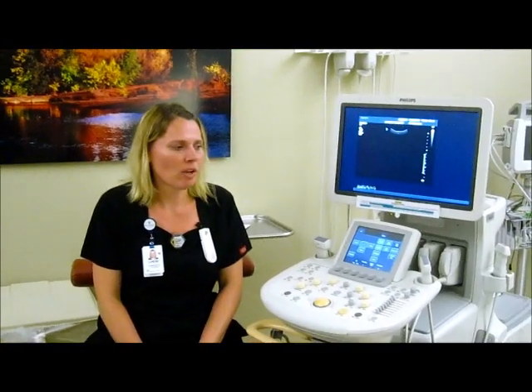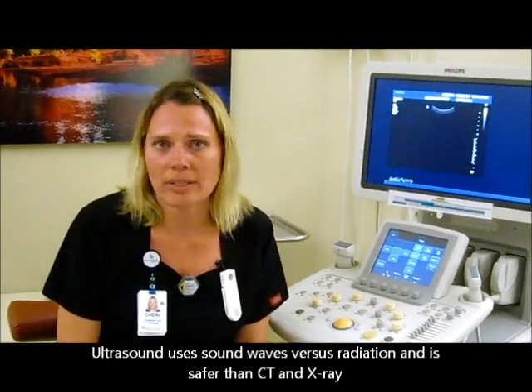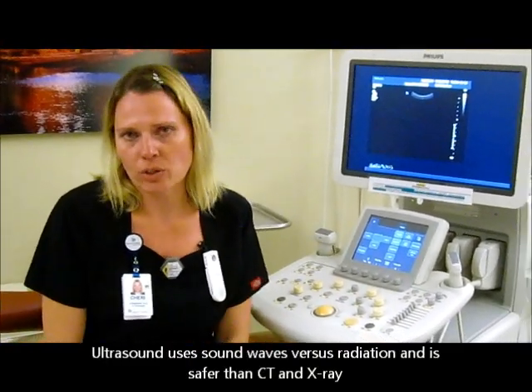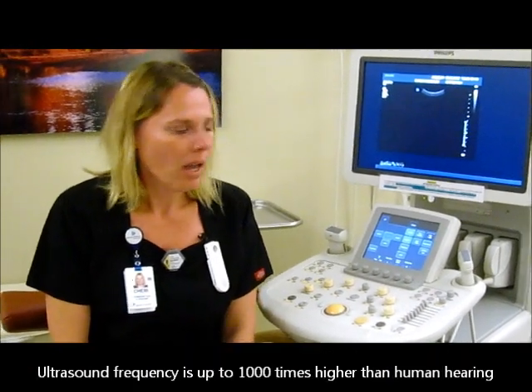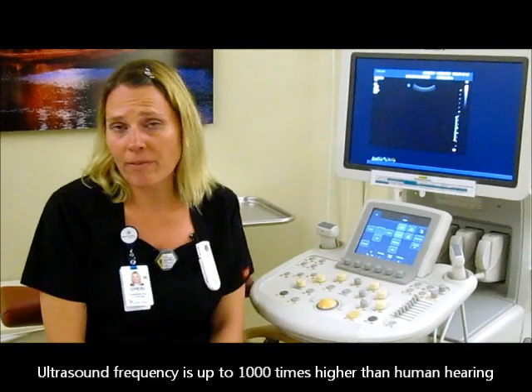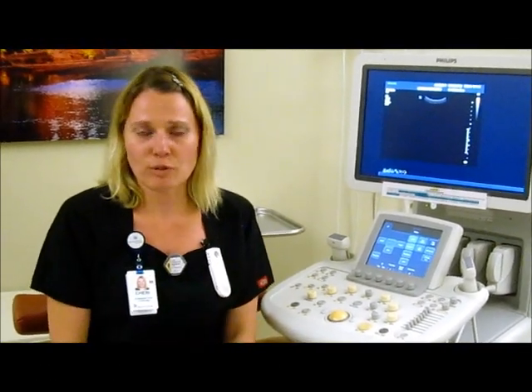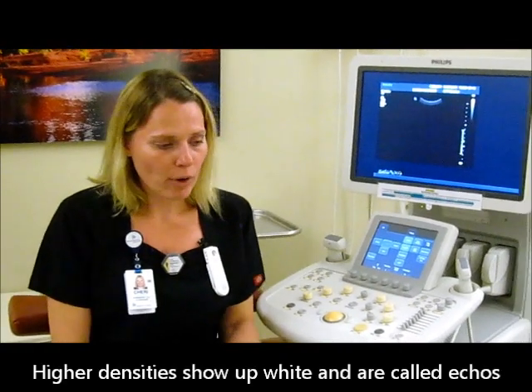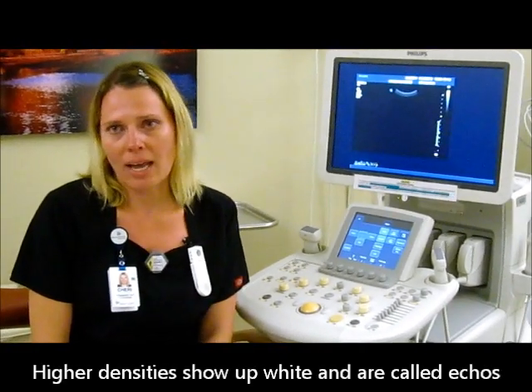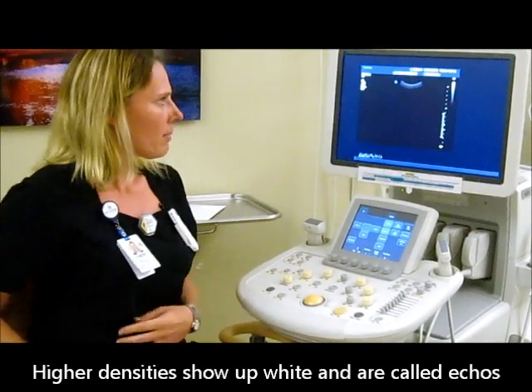Okay, the main purpose of ultrasound is it's non-ionizing radiation, so it's very safe. You can use it on pregnant women, children. You can use it as many times as you need to. There's not a lot of biological harmful effects to it. Mainly how it works is it sends sound waves that are above the range of human hearing into the body and waits for them to come back. It listens for an echo. Depending on how far away the organ and the structures that you're looking at is what it's going to appear like on the screen. That's the pretty basic way it works.